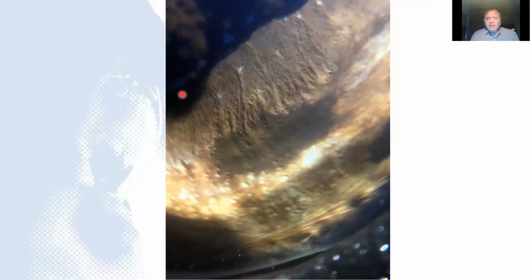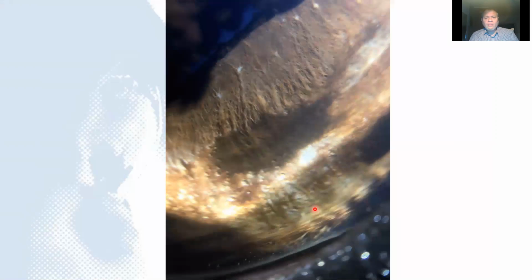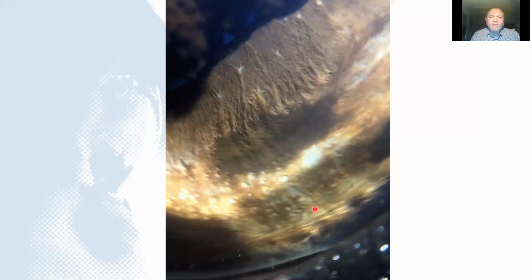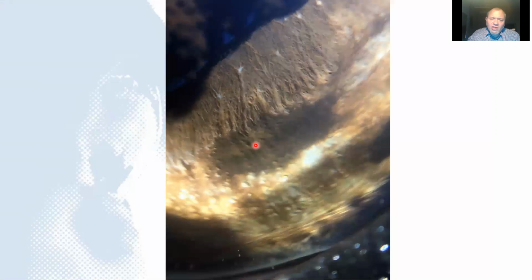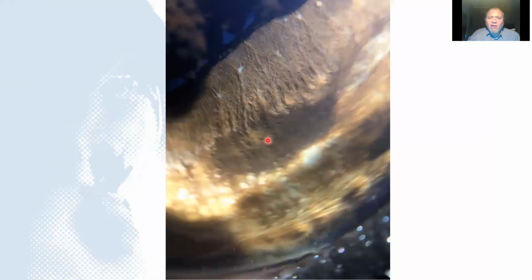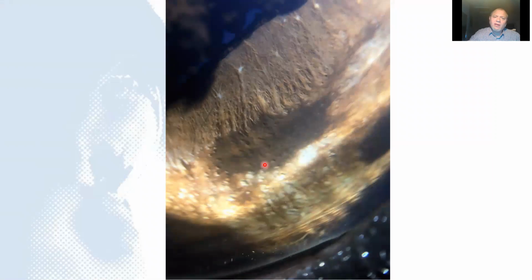Another stacked image, again illustrating the dynamics of the tear film. It's the lower lid, the limbus, and this is the lacrimal lake. And you can see as we move backwards and forwards, it's like the tide coming in and going out. But the point of the photograph, partly because it's beautiful, actually is to document this iris lesion here, which you can see has a typical carpet-like appearance, and it's just starting to affect the iris architecture. And this is very typical of an early iris melanoma.